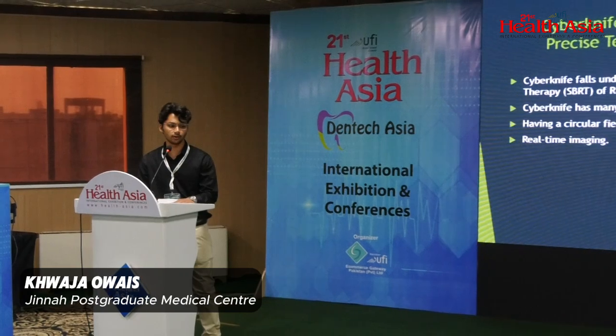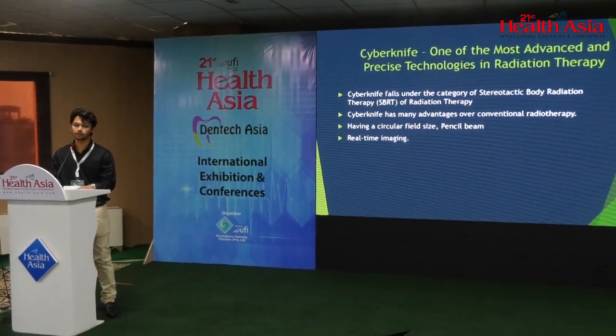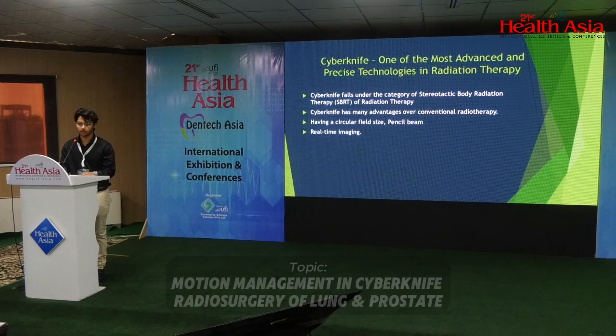My name is Khwaja Owais and I'm here to give you an insight of how we manage tumors affected by motion in Cyberknife radiosurgery as compared to other conventional or 2D radiotherapy technologies. First of all, I would like to give you a brief introduction of what Cyberknife is. Cyberknife falls under the category of stereotactic body radiation therapy, also known as SBRT, under the field of radiation therapy. It has many advantages over older conventional radiotherapy.